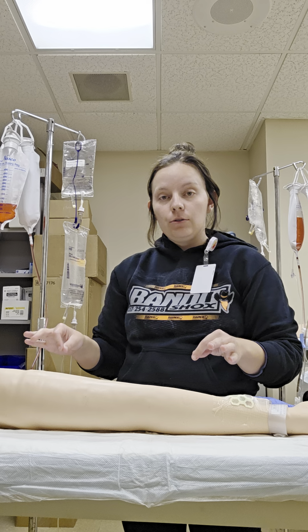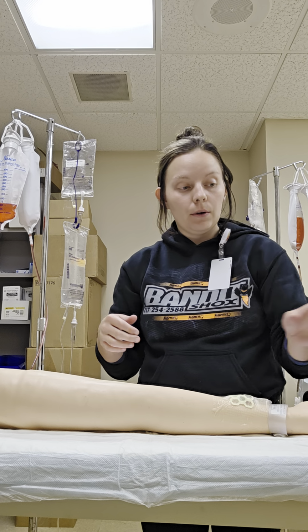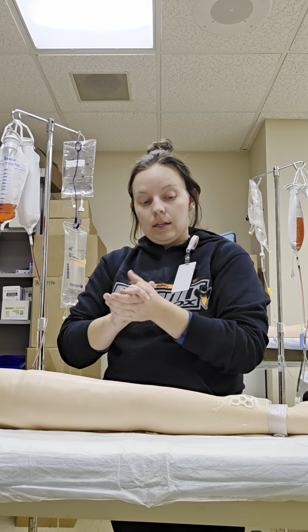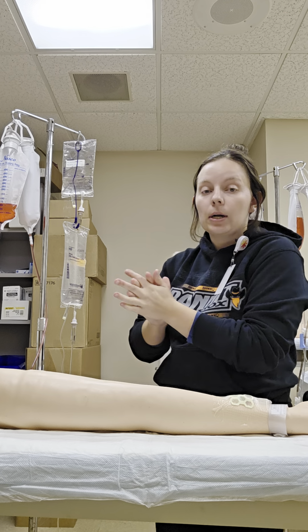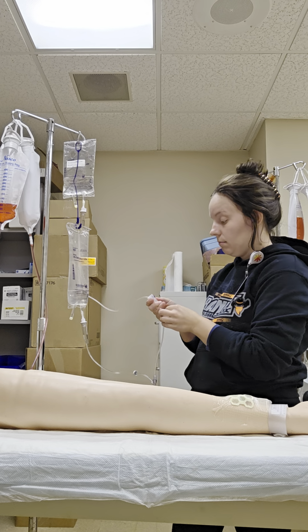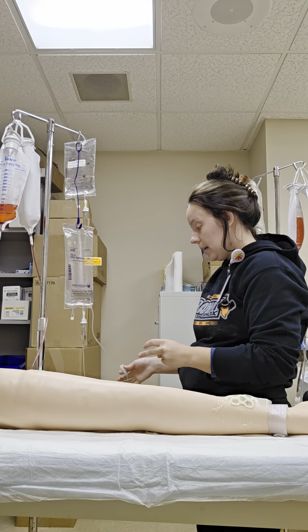Once his infusion is complete, I would go ahead and come back into the room, perform hand hygiene. I'm going to go ahead and turn my roller clamp off on my secondary tubing. So I'm turning it off. So he's clamped here on his secondary.